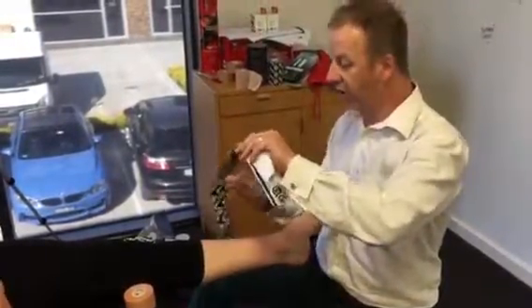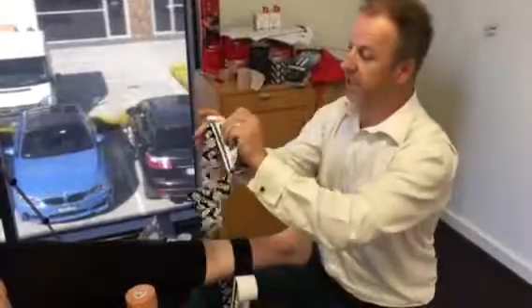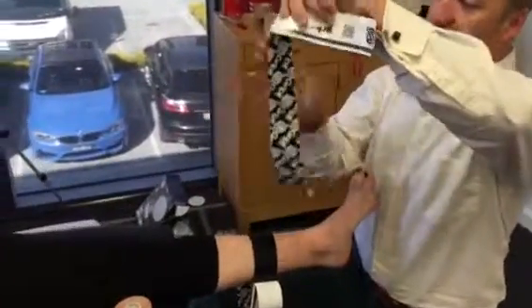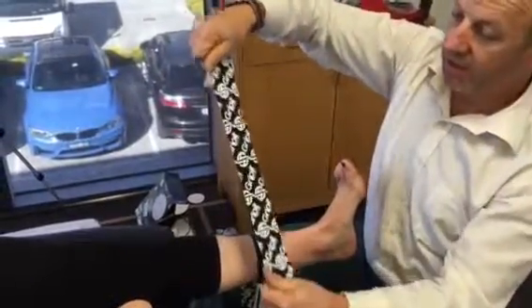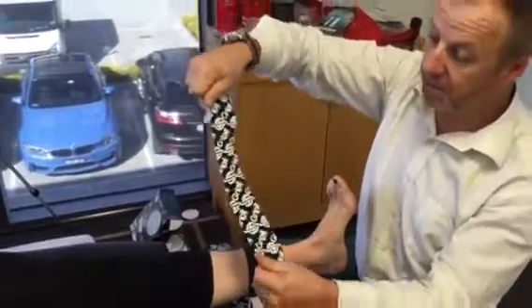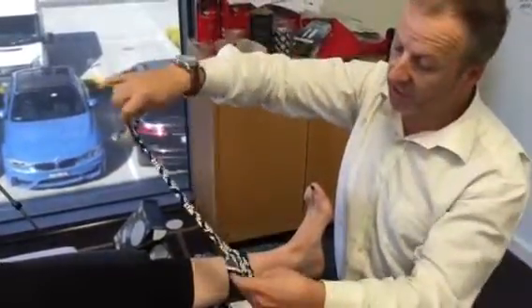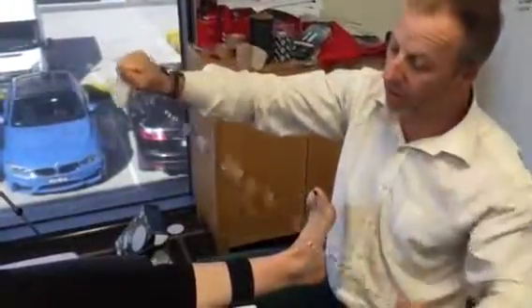It's a nylon, highly elastic tape that stretches about 270 to 280%. If you look at the product here — nylon and a bit of spandex — so very, very stretchy. It's different to kinesiology tape, which only stretches 180%. This is 270 to 280. And if it weren't on the skin, it would actually stretch ridiculously. You can see there that it is a very highly elastic tape.